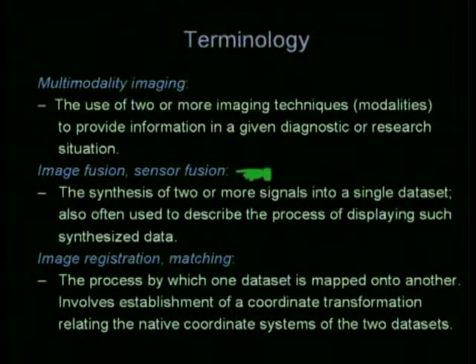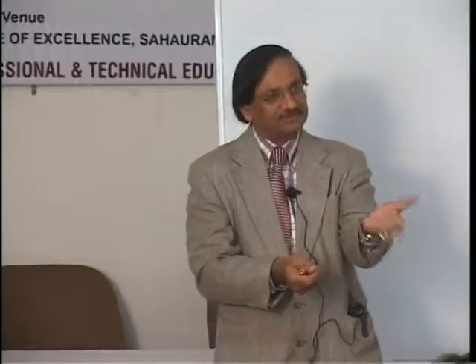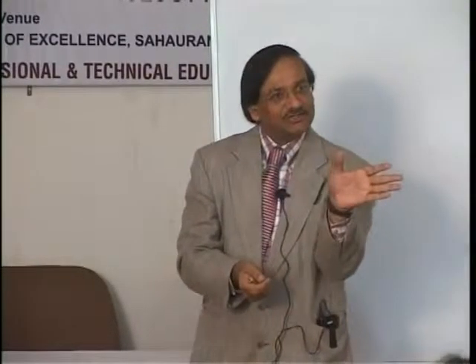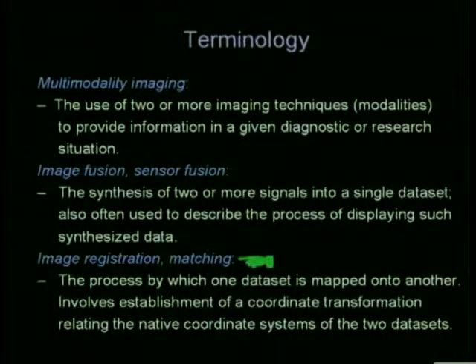Image fusion or sensor fusion is totally different than fusion imaging. Image fusion is when you are synthesizing two signals into a single one, and you are presenting that synthesized data or synthesized signal. This is image fusion. This has nothing to do with fusion imaging. And of course, the most important part of fusion imaging is the registration.